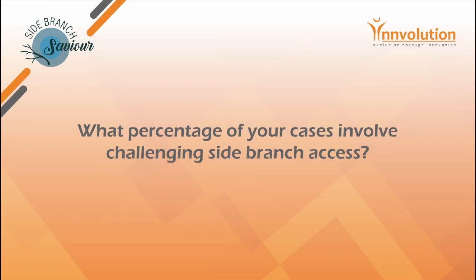So we deal with about 100 to 120 angioplasties a month, and of them maybe 40 to 50 are complex bifurcations. Whenever we see a bifurcation lesion, our main aim is to protect the side branch, which is our main interest. Why? Because most of the MACE, or the events that we see in our day-to-day practice or follow-up, are side branch occlusion, especially when there is a left main bifurcation.